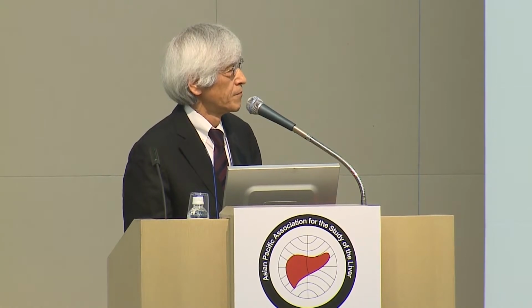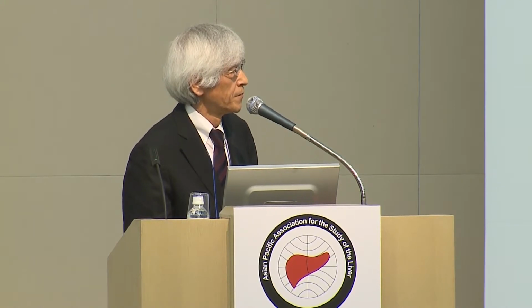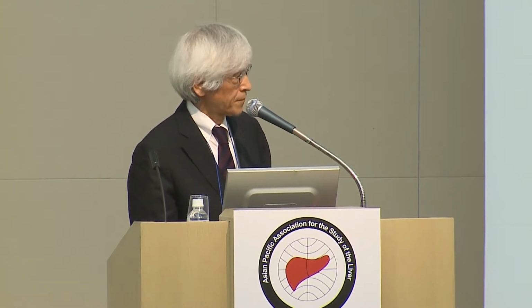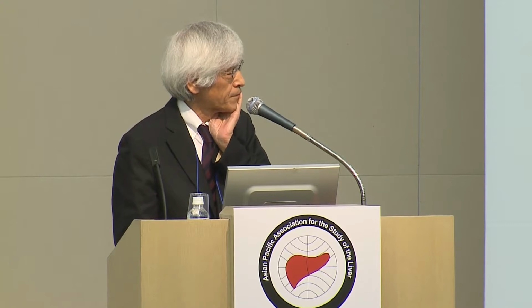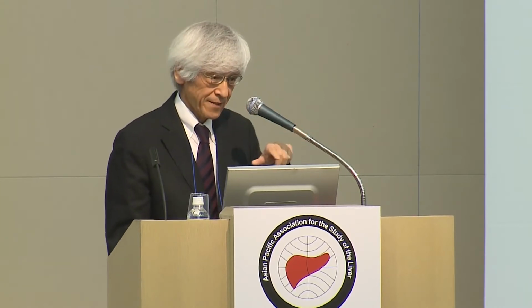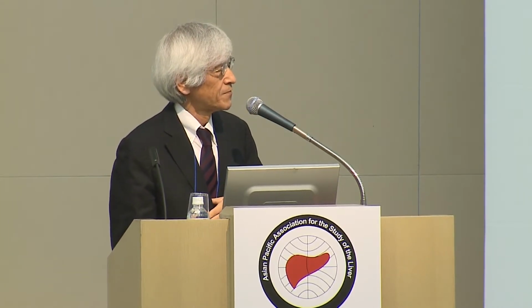So you said beautiful ablation. For beautiful ablation, you should know the corona enhancement area. Yeah. Okay. But it's very irregular, and a 5 millimeter safety margin is wrong. Yeah, especially in more than 3 centimeter hypervascular tumors. But it's quite difficult to know the exact corona enhancement area using the usual modality. You should do the CTHA if you would like to know the exact corona enhancement area.